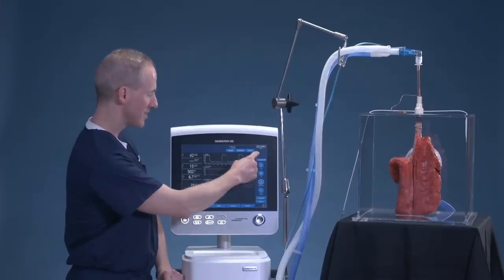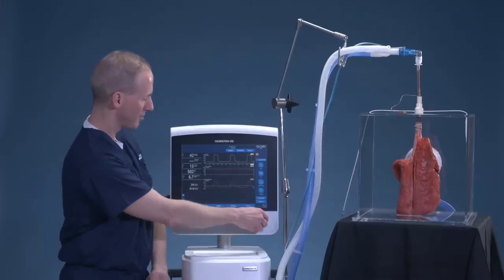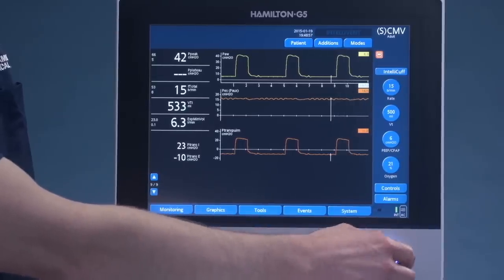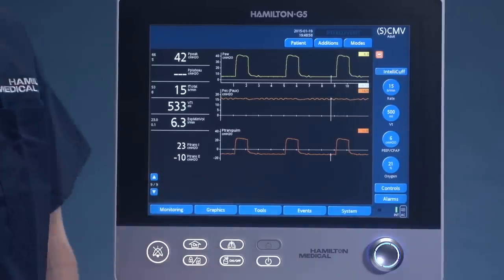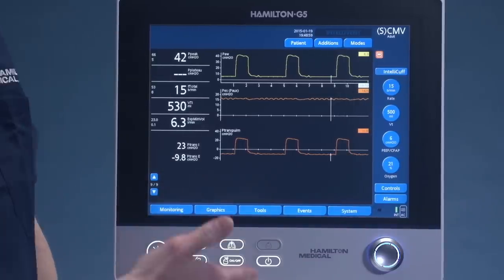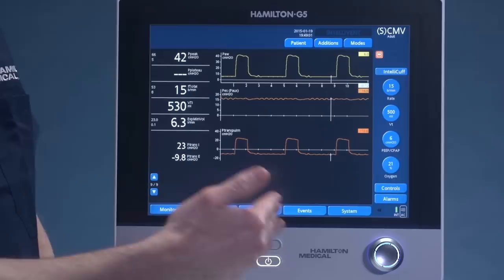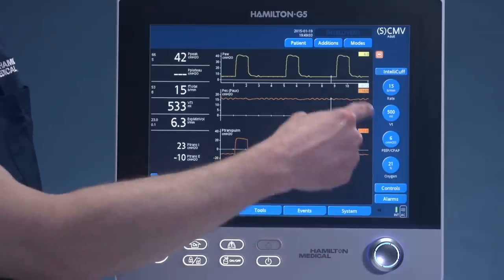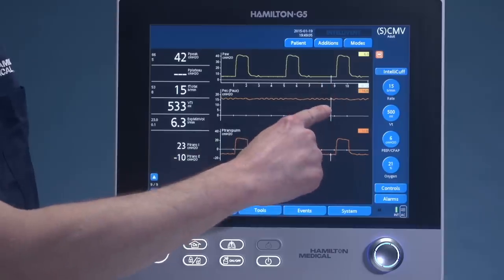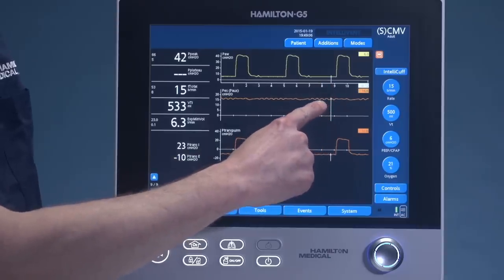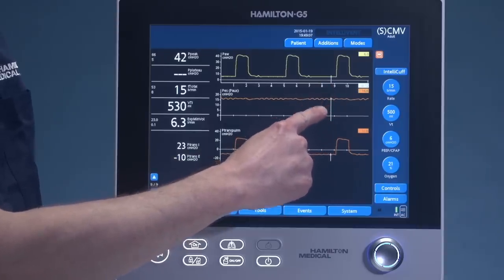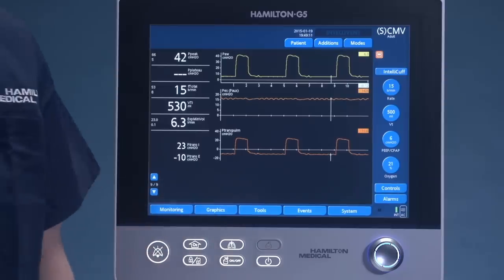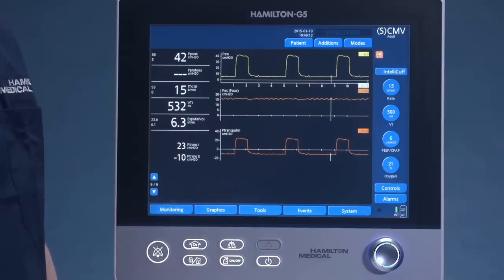Let's go to the G5 and scroll back to the period just before the beginning of the inspiratory phase — essentially at end-expiratory. Airway pressure reads 6. The pressure outside the lungs is now 16. Six minus 16 gives you a deficit of negative 10 centimeters of water pressure.